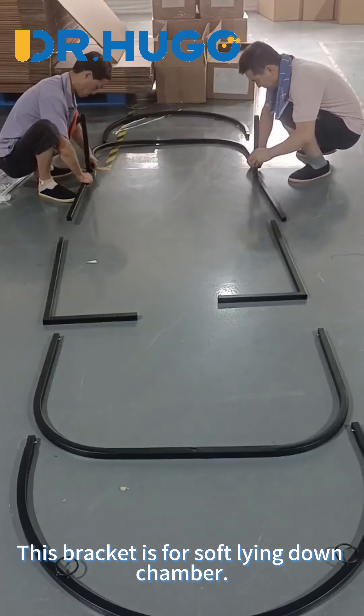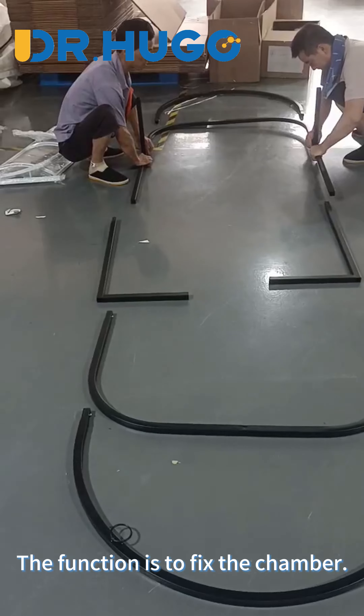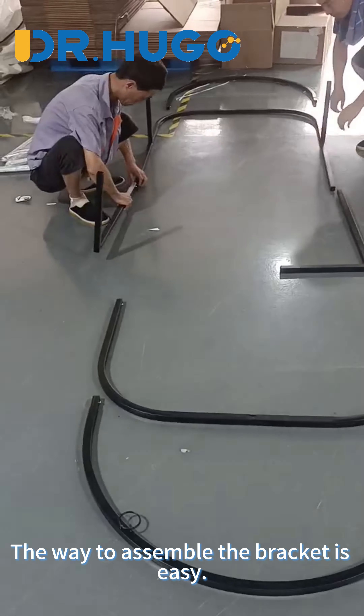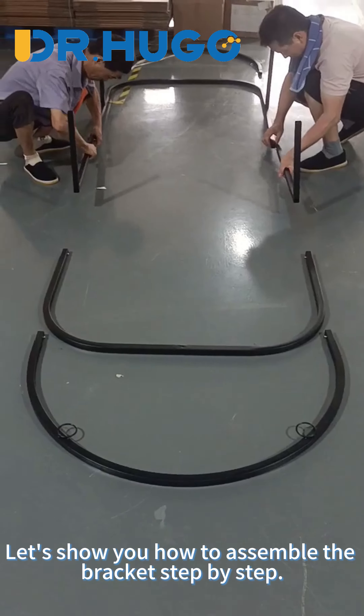This bracket is for the soft lying down chamber. The function is to fix the chamber. The way to assemble the brackets is easy. Let's show you how to assemble the brackets step by step.